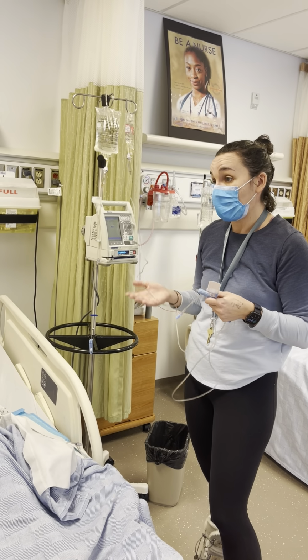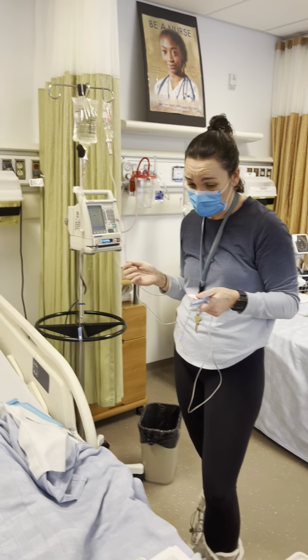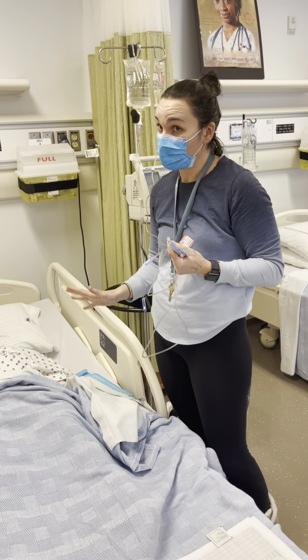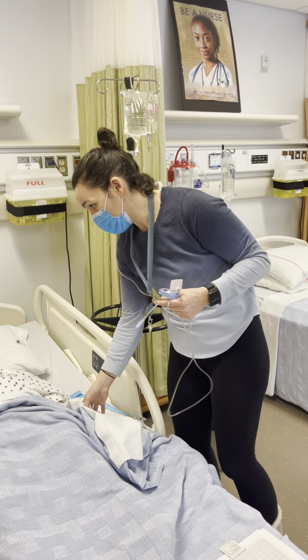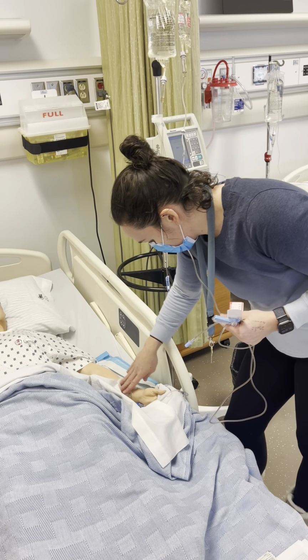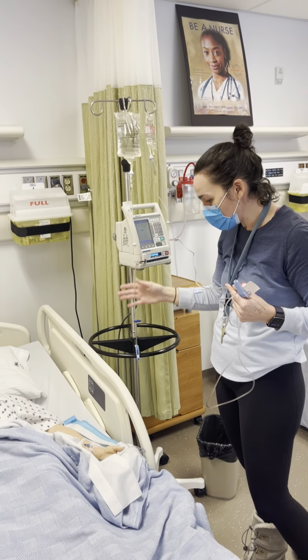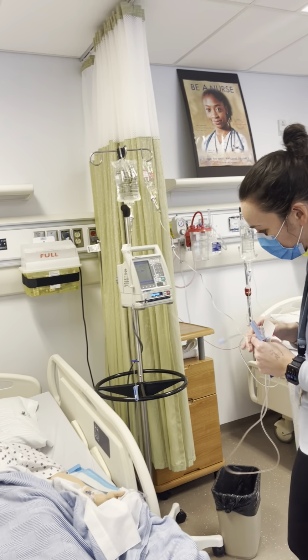We're going to tell him we'll be back to check on him every hour after the infusion starts to check his blood glucose until it's in the normal range. Then we'll switch to every 4 hours. We're going to assess. First, we check his blood glucose, obviously, to make sure he's not hypoglycemic, and we'll check the patency of his IV that's running here, and we'll look at his IV too. We see he's got normal saline running by gravity, TKVO, so that's good. Now the clamps are open.